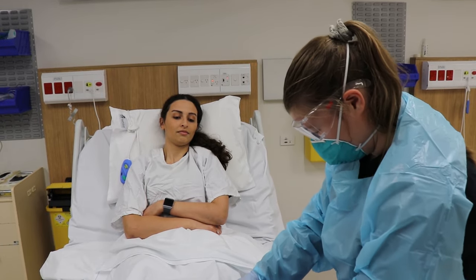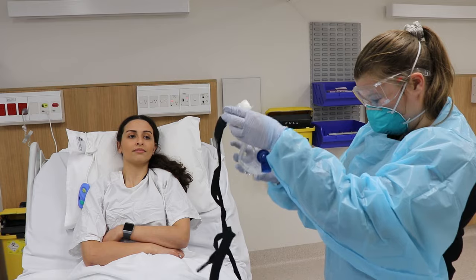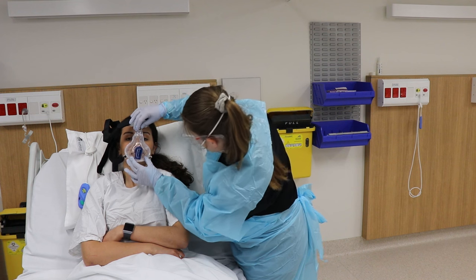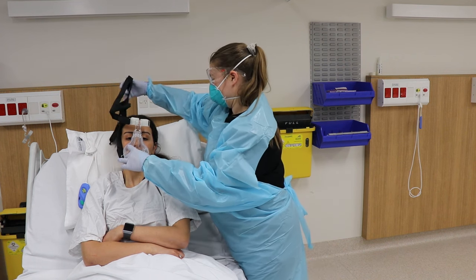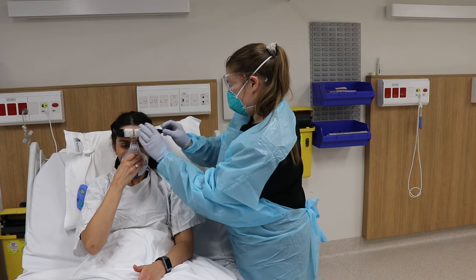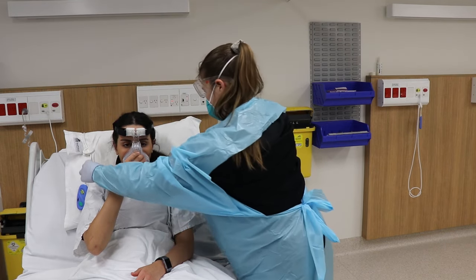So in this case — too big, too small, and this one might be just right. Remove the straps and let's have a look. I can see the bottom of the mask going underneath. If you could lean forward for me — put this around. Now if I could get you to hold that mask tight onto your face, I can adjust these straps, adjusting loosely initially, and then to get symmetry, put both straps at the same time.